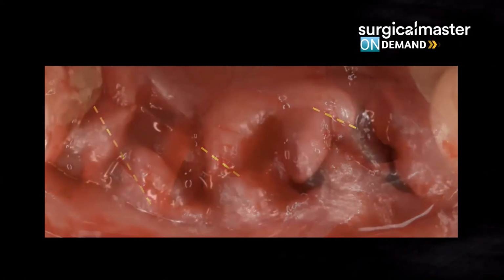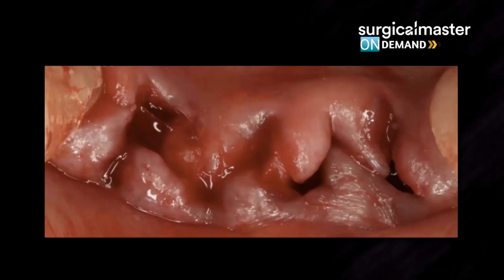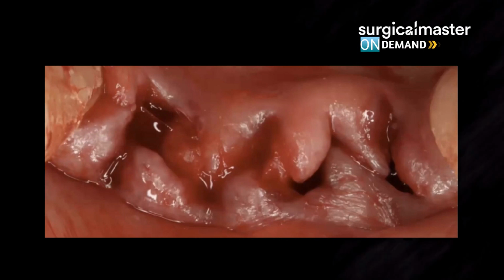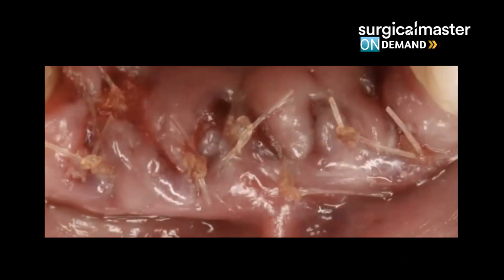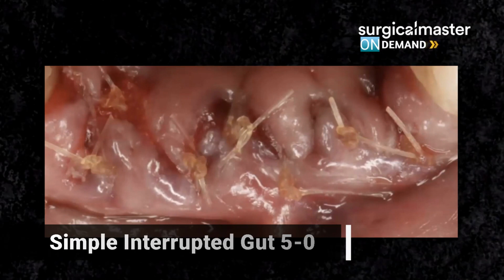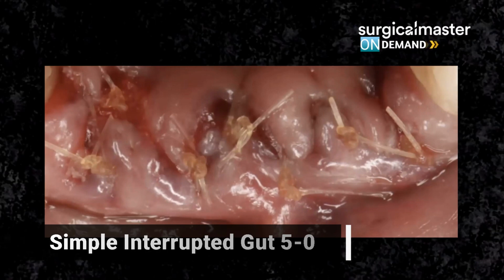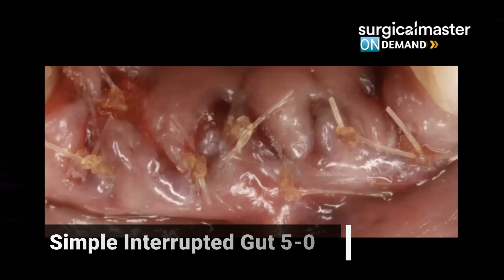Each papilla has its own mobility, and I can start experimenting with mobilizing the papilla, almost like taking your hands and crossing your fingers together, both hands, almost like a prayer. And then the only thing you need to do after your grafting is place simple interrupted sutures, 5-0, because these are small tissues, so you need to use small needles and small sutures, and you'll get primary closure for the most part. What does it mean? You'll have faster healing, better patient experience.